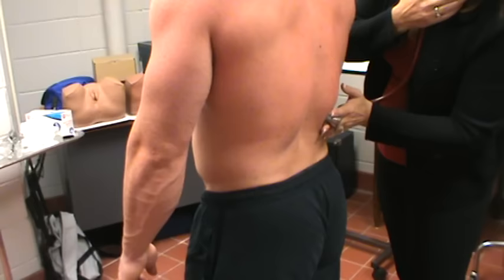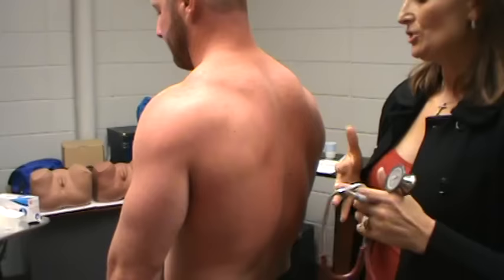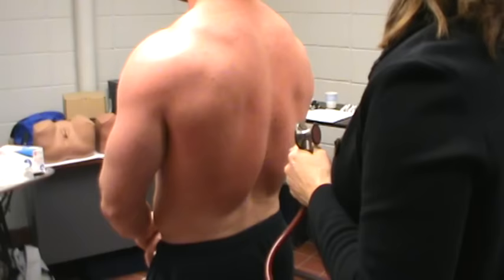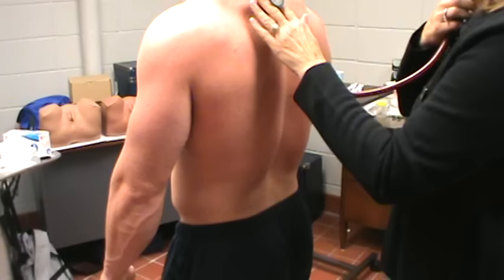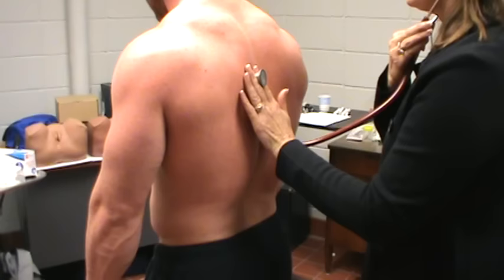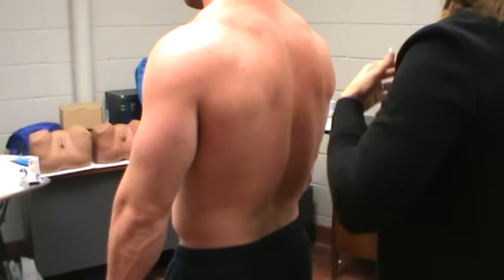I'm going to check one more thing. This test is called bronchophony, and you're going to say the number 99 for me again, but this time you're going to do it every single time that you feel my stethoscope touch your back. This is also just checking for fluid or any kind of consolidation in your lungs, okay? If you had fluid or consolidation anywhere in your lungs, that would have been very clear to me. But it was very muffled, so that's good.